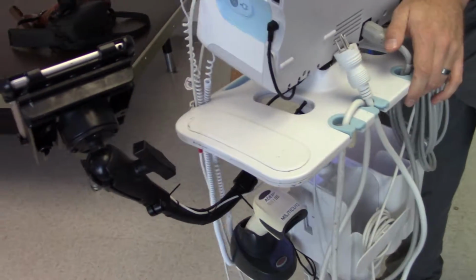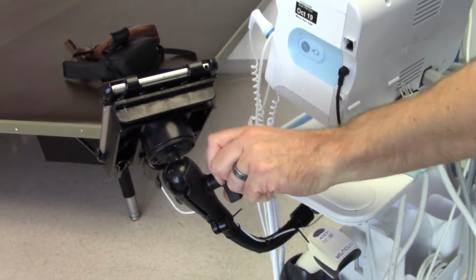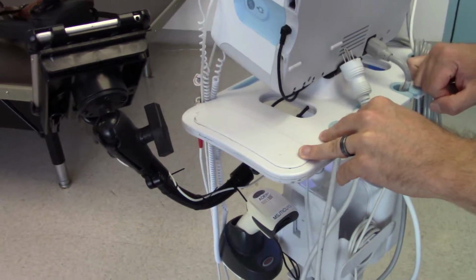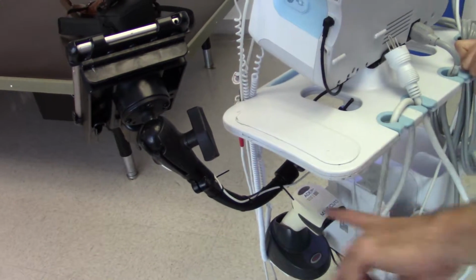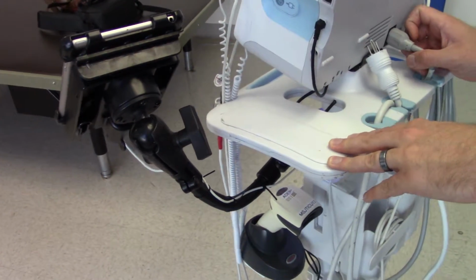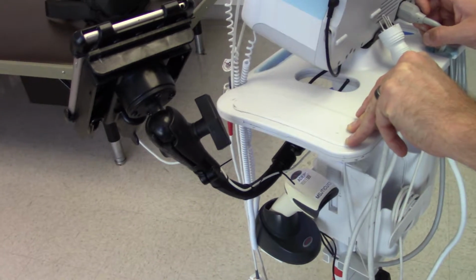And that's really common. Probably any one you go out on the floor is going to be misadjusted and kind of flopping around. So what are your biggest problems, like one, two, three with these armatures? Biggest problem is definitely the security of this arm. Because it's flopping around, yeah. The flopping's a problem. Correct. And so it's requiring constant readjustment. That's correct. And so eventually you just decide, well, it's broken, it can no longer be readjusted. I've got to order a new one.